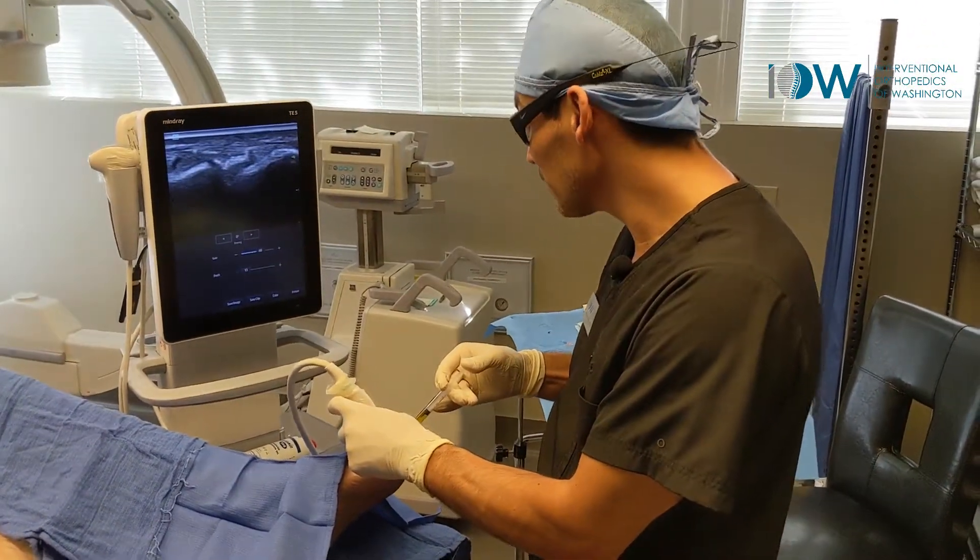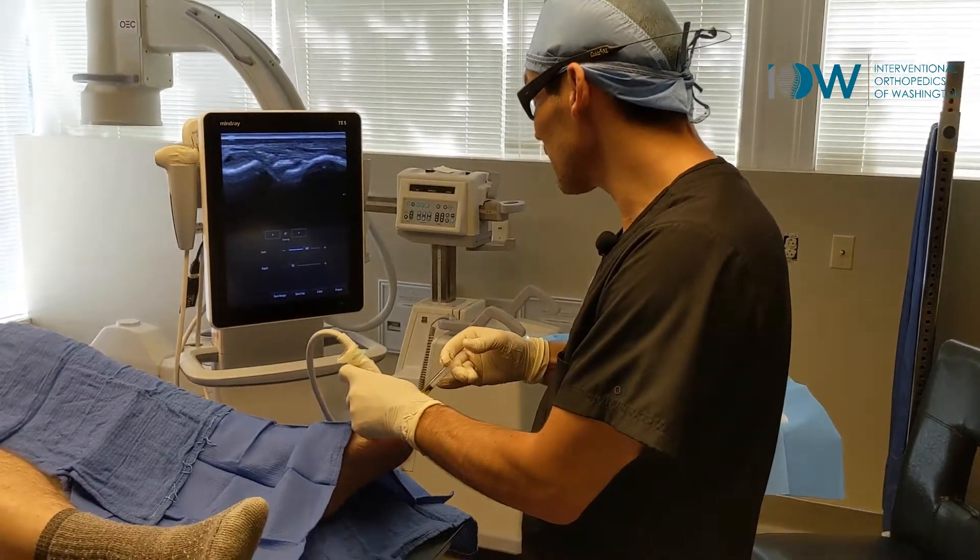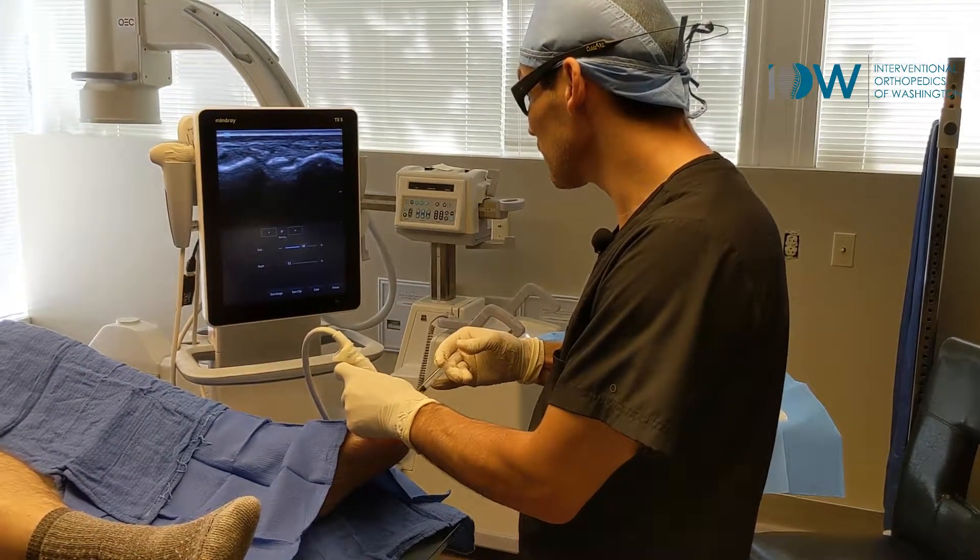Most people are just injecting the intra-articular space without treating this capsule. It's important to get it.